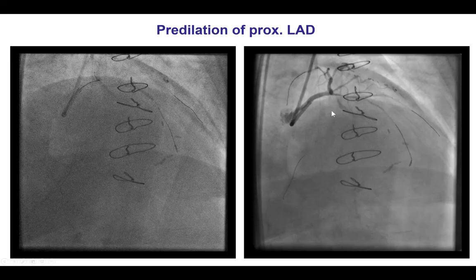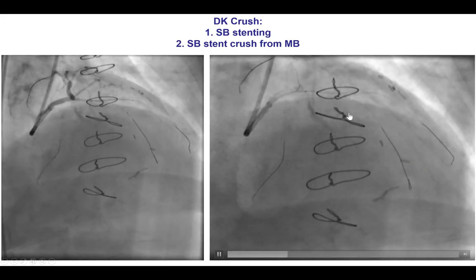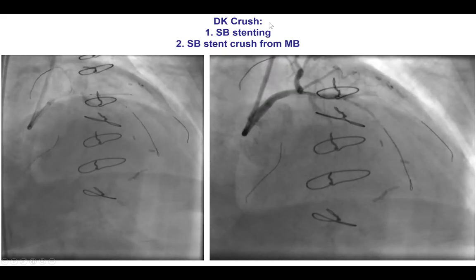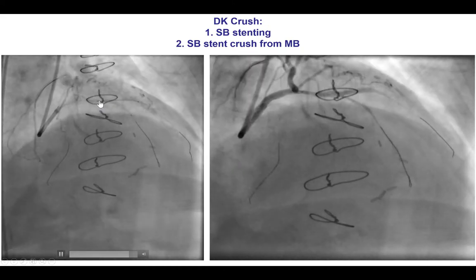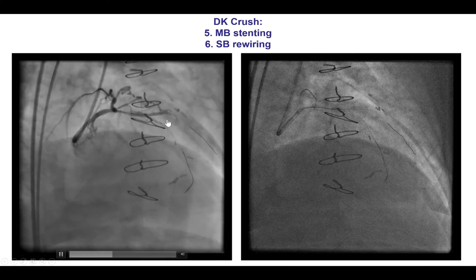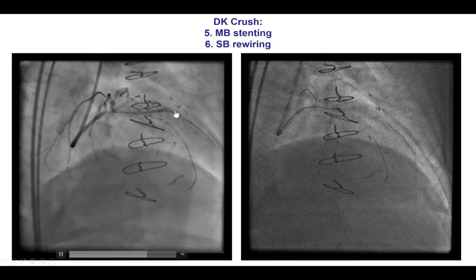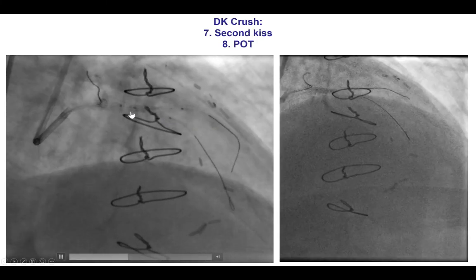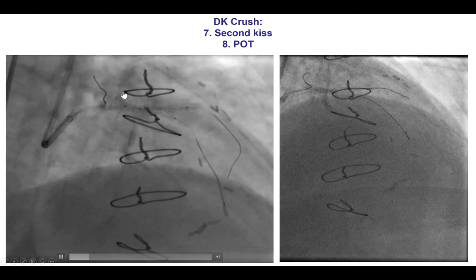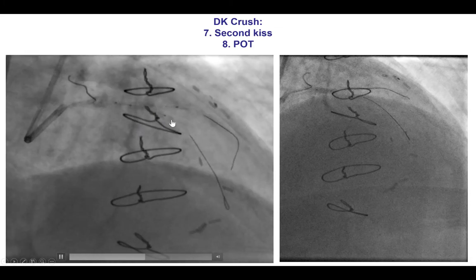After predilatation, flow was restored into both vessels. Because there was significant disease in both the diagonal and the LAD, we decided to use the DK crush technique, or double kiss crush. A stent was placed into the diagonal branch, then crushed with the balloon in the main branch. The diagonal was rewired and the first kissing balloon inflation was performed. Then a second stent was advanced into the main branch and deployed. The side branch was rewired and the final kissing inflation was done. We also performed POT — proximal optimization technique — to ensure that the proximal part of the stent was well expanded.